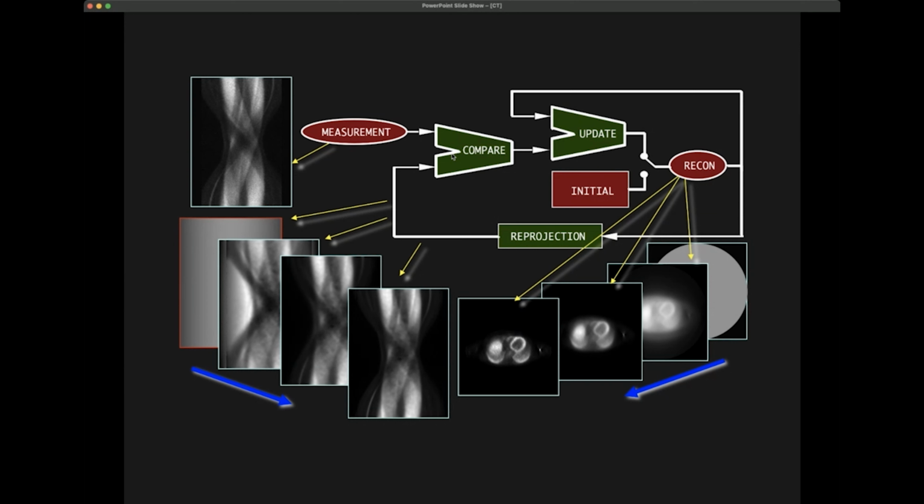Or what also is the case is that if we use the theoretical reconstruction, what we assume is that this measurement is perfect, which means that the scanner has to be perfect, and which means that the angle that we measure has to be perfect.